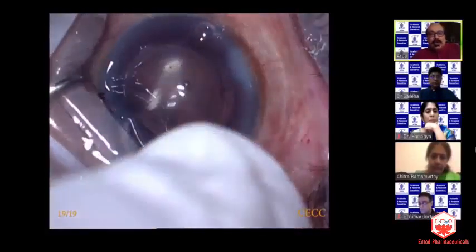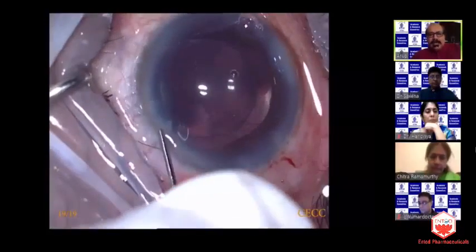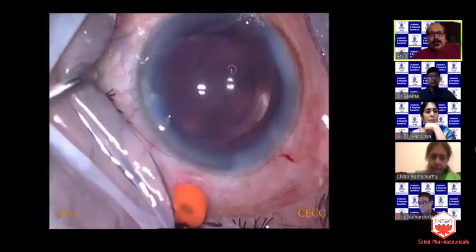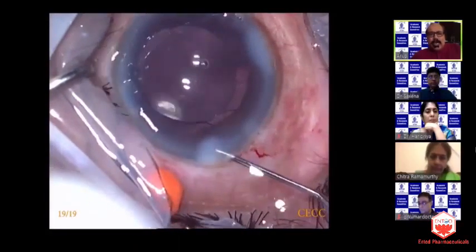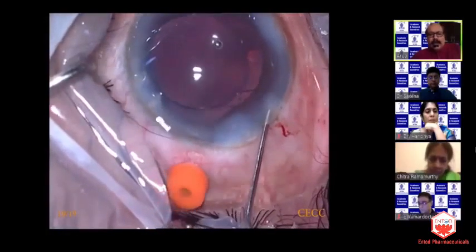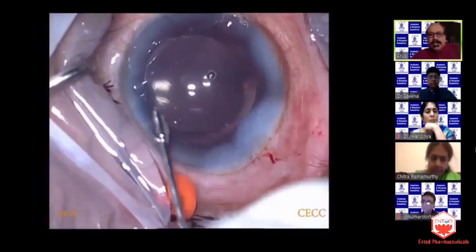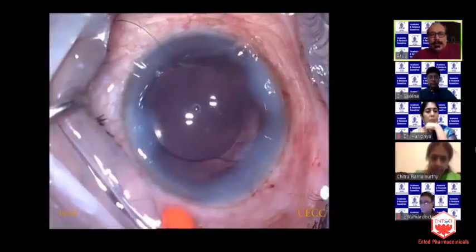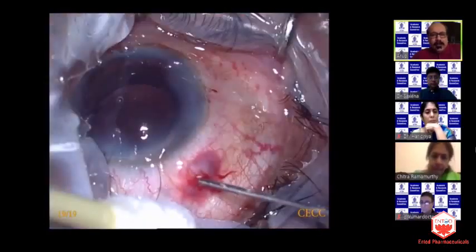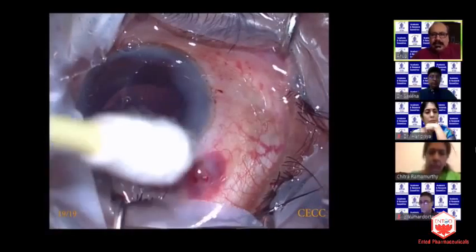So, making sure that the lens is well centered, I concluded the surgery by again having a relook at the sclerotomy site. Some amount of vitreous does come out. So as you remove the instrument there, I performed a little bit of vitrectomy to remove the residual vitreous, and the conjunctival flap was cauterized and left sutureless. The patient did extremely well on the first postoperative day. And that is the end of my first case.